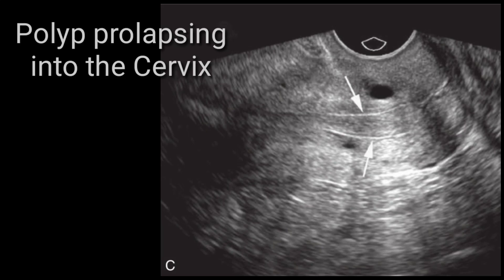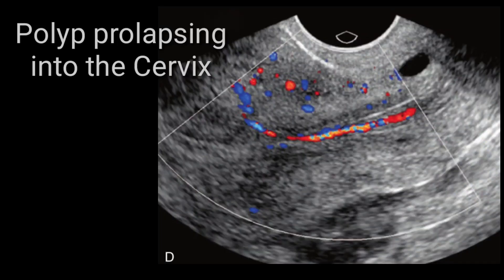A polyp may be confined within the cervical canal or may prolapse from the endometrial cavity. The endometrium is a very common area for polyp development. Polyps can be single or multiple, small or large. If large enough, they are likely to prolapse downward into the cervical canal. On Doppler imaging, this polyp shows increased vascularity — hypervascular polyps are important to note.